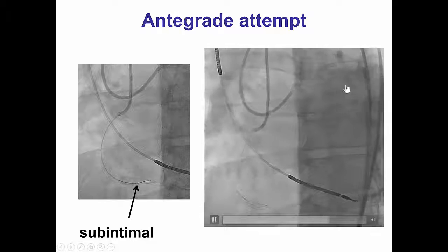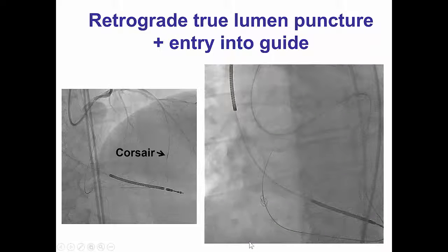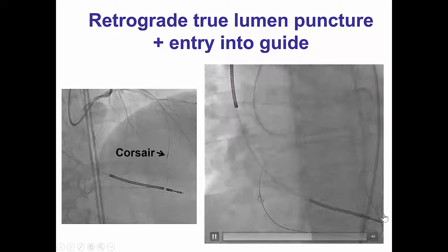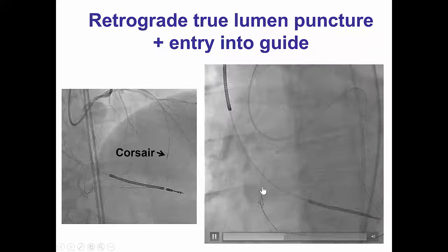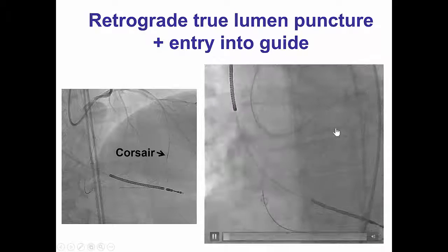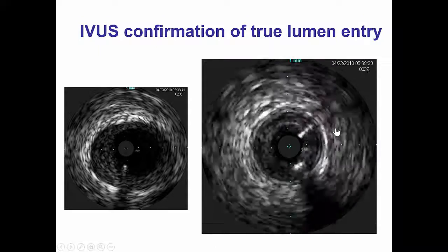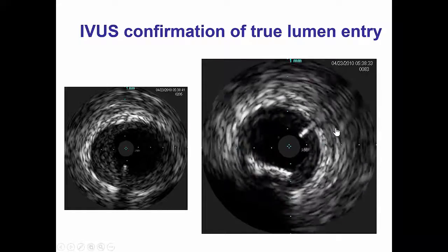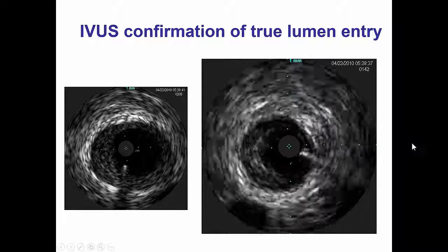Given the presence of good collaterals from the LAD, we changed to retrograde crossing. We were able to advance a Corsair retrograde into the posterior descending artery and then easily advance a retrograde guidewire into the antegrade guide catheter. Proximal true lumen position of the retrograde guidewire was confirmed with intravascular ultrasound, showing that the wire is indeed in the lumen.